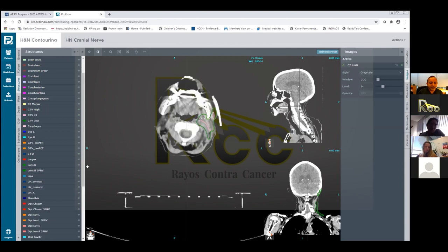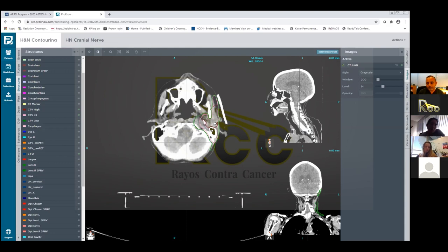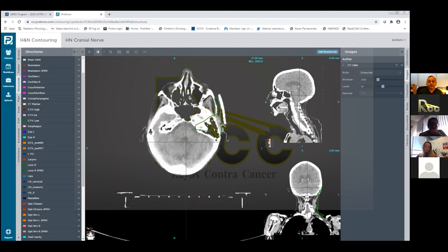So these cases are never easy. They're very tricky, especially in these post-op settings. So this woman had really zone 1 disease ultimately, even though she had lots of clinical findings of her perineural invasion. But these are the kind of patients where you should really be aggressive and cover. And then, as we were saying earlier, these are the patients where we will take the surface of the brainstem up to 60 gray easily. And that's very easy to do.